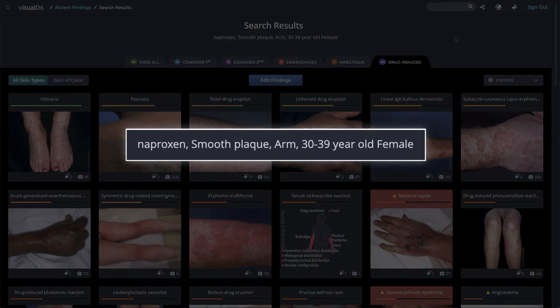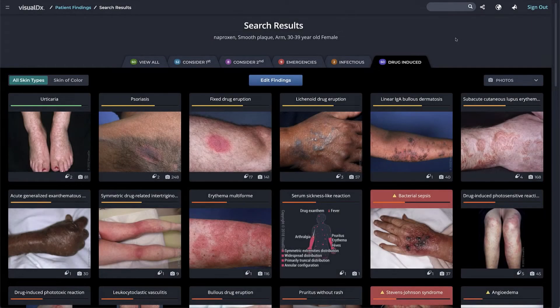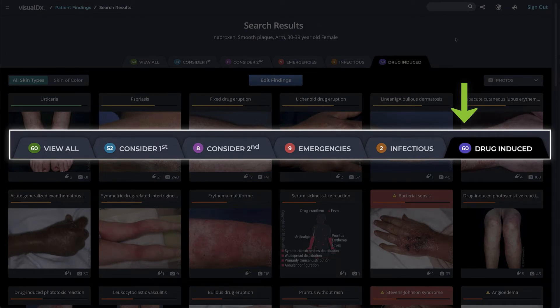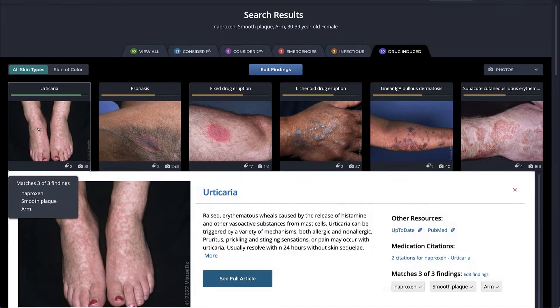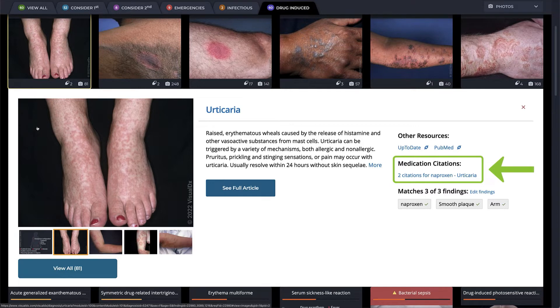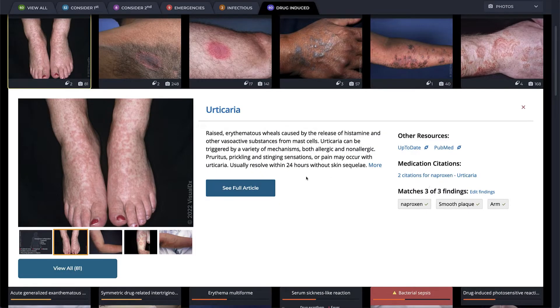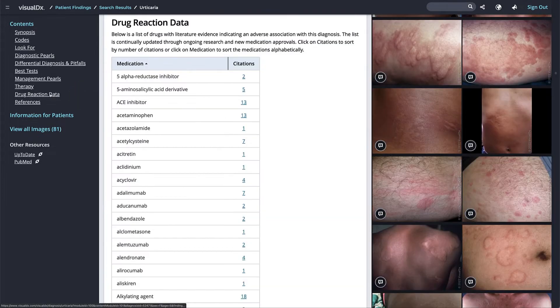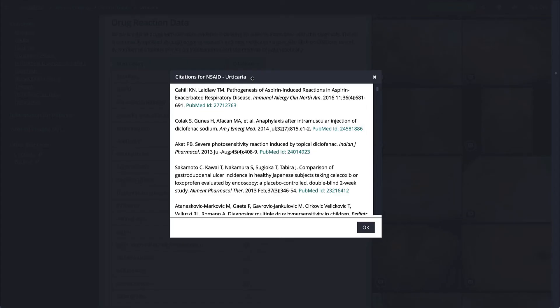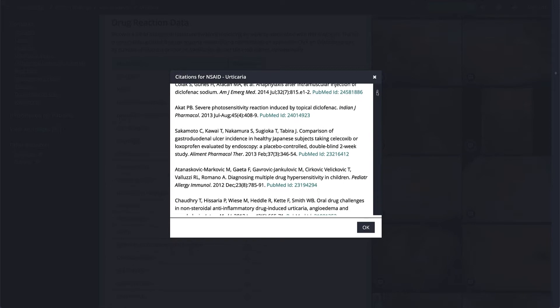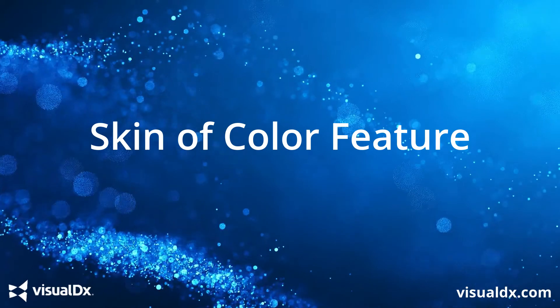Our patient is a 35-year-old female who took naproxen and noticed a smooth plaque appear on her arm. Let's use VisualDX to see if this could be an adverse medication reaction. Since naproxen is our chief complaint, the Drug Induced tab appears first. The number in the tab indicates how many diagnoses are categorized as drug-induced. Click on a diagnosis for a quick glance — the medication citations associated with this diagnosis are front and center. Click through to the full article to review full drug reaction data. You can sort the list by medication name or number of citations; in this case, NSAIDs have 55 total citations associated with urticaria.